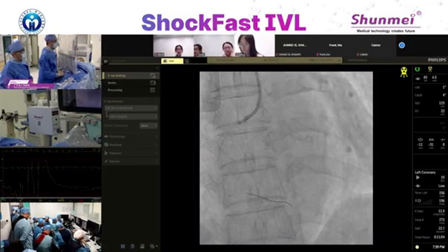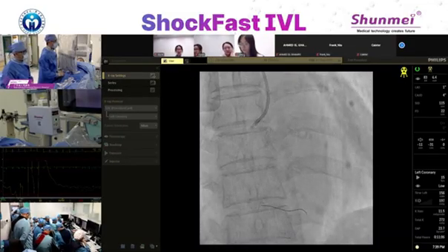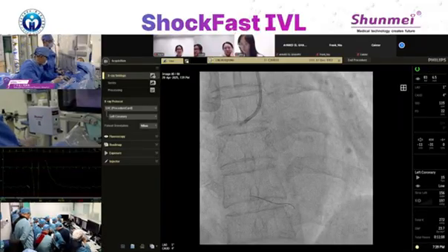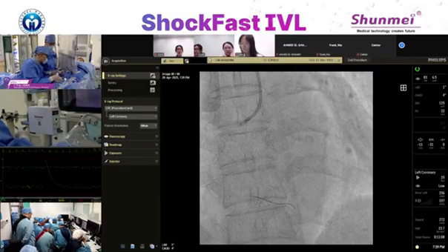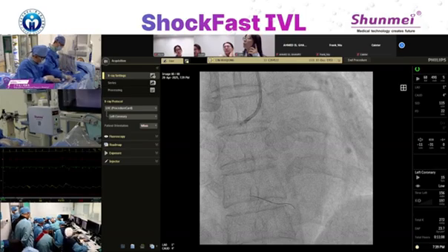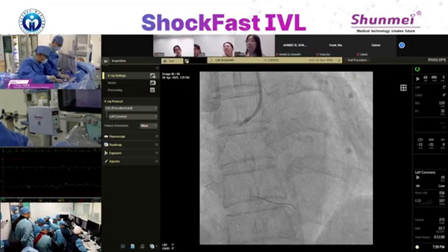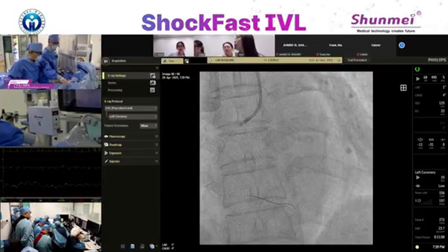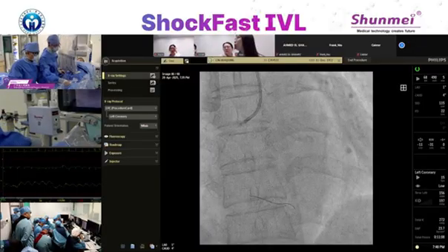The waist is here. Okay. Let's go up. Four, yes, four big hits. Okay, it's different, I opened it up. I'll double hit the button.